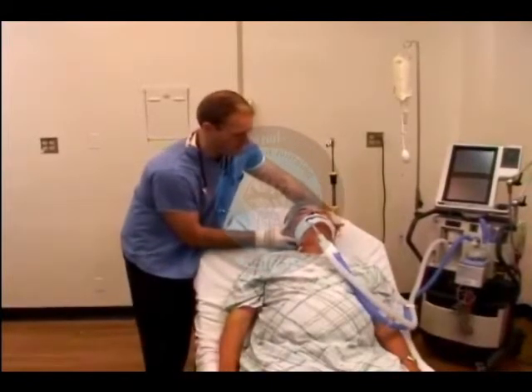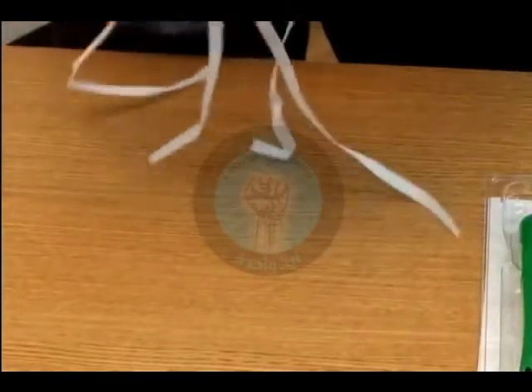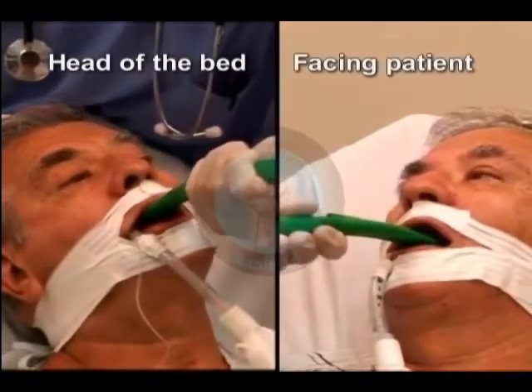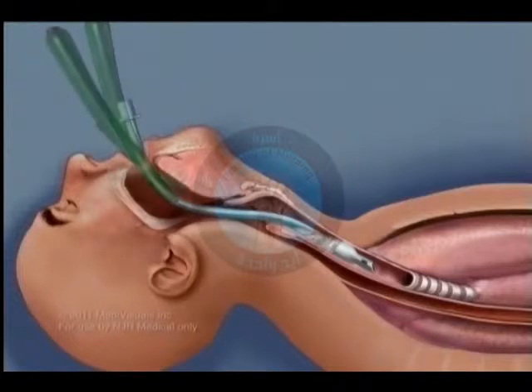to facilitate opening of the airway. Put on your gloves and a mask with facial shield for your protection. Insert the No-Bite 5 into the patient's mouth. Depress the tongue to facilitate opening of the airway. Turn on the light.